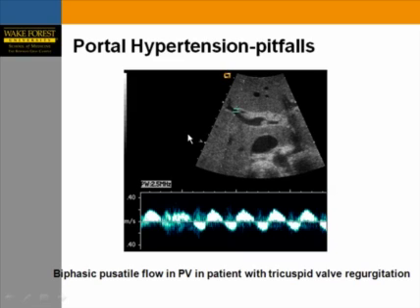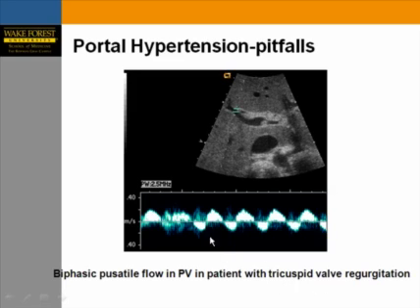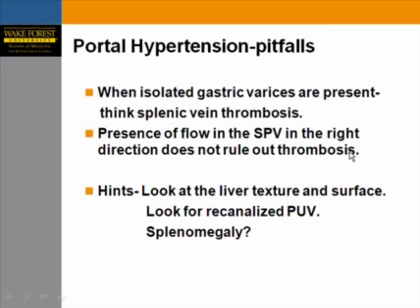Another pitfall: do not interpret biphasic flow as cirrhosis or portal hypertension automatically. This interrogation of the portal vein is from a patient with tricuspid valve regurgitation. This pattern can also be encountered in patients with right-sided heart failure and tricuspid valve disease.